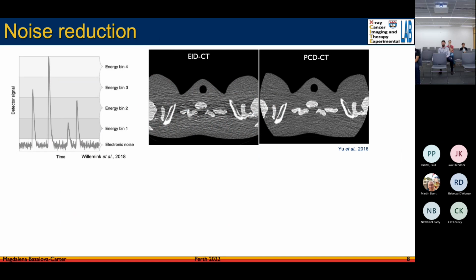I'm going to be talking about a few applications. Again, this will be work done by other groups, not by my group, but eventually I'll talk about our system as well. When you talk to people about photon counting CT, there are basically two obvious advantages. One is that since you get to select thresholds, you can select a threshold above the noise of the system. That means you should be able to get images that are less noisy, which seems advantageous. The other advantage is high resolution.